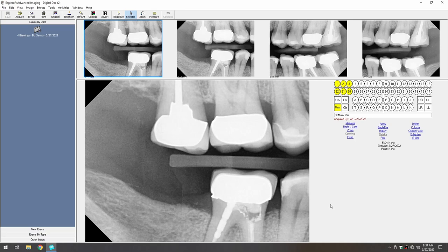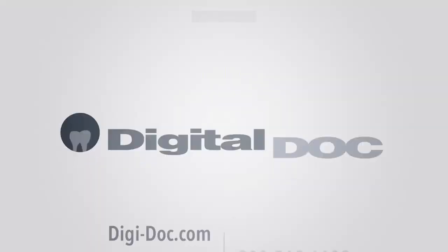This concludes the Installation and Integration Guide for DigitalDoc's Blue X-ray Sensor in Patterson EagleSoft.